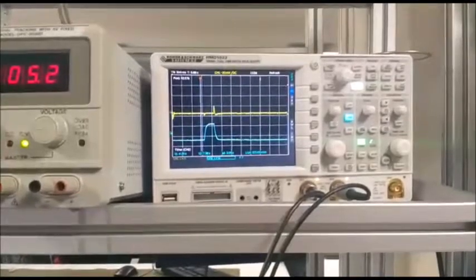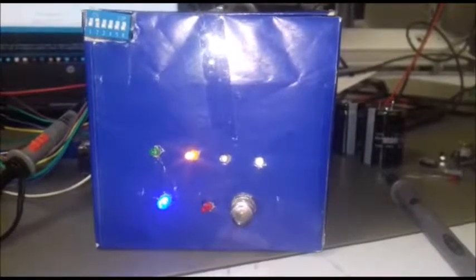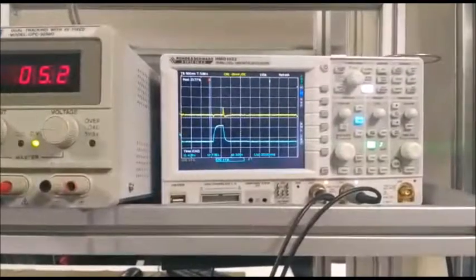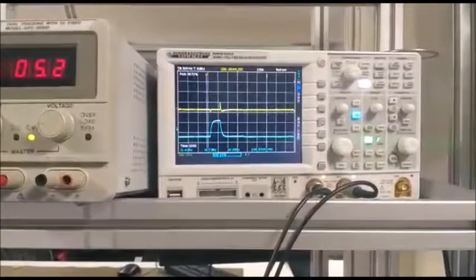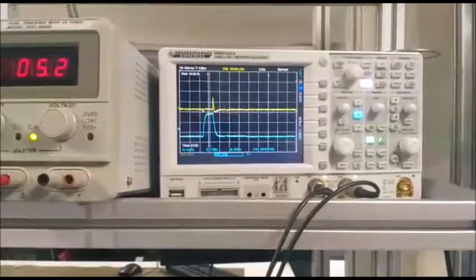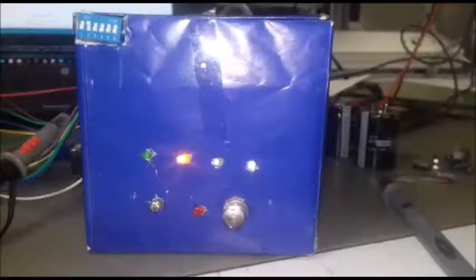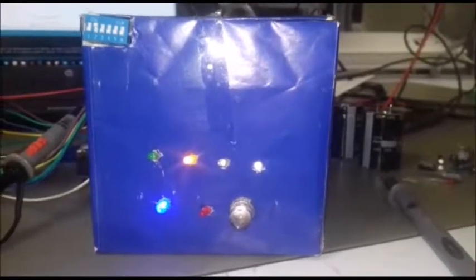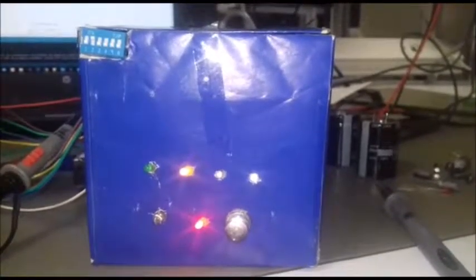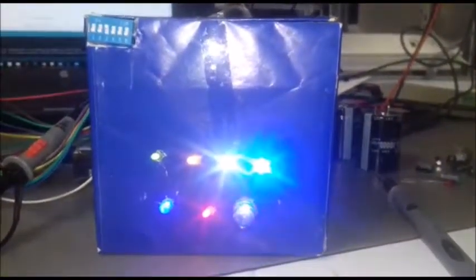As the patient is still without a signal, the last discharge is made, and again the user is shown on the indicator LED. This time it is 120 joules of energy. The equipment is only designed to give 3 discharges. So if after the third discharge the patient has no vital signs, the red LED turns on and it makes an arrangement of lights to show that the equipment has finished its function.